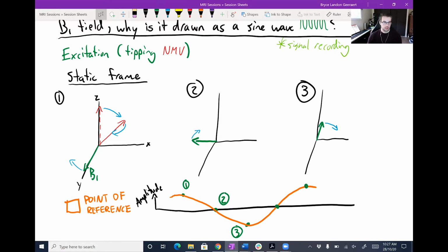like I mentioned, the parallel alignment of protons is a lower energy state than the anti-parallel alignment, and this actually varies with magnetic field. I think it's called the Zeeman interaction. It's in the book. I was just going to flip to the page, but I'll just move along. The actual name isn't really as important as the concept. But it turns out that if you increase the magnetic field, the difference in energy between parallel and anti-parallel increases, which means that there's going to be a bias towards even more protons in that surplus of up orientation, producing a stronger net magnetization vector for us to work with.